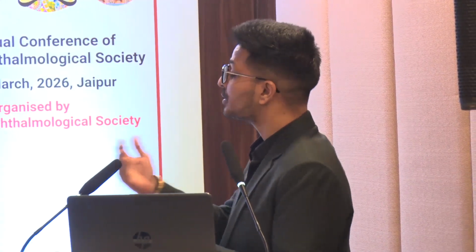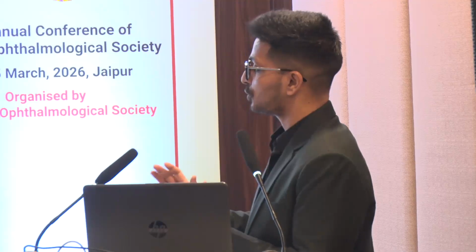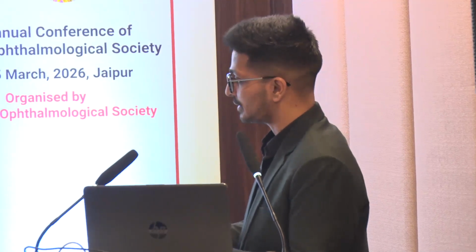Do you think that minus 11? The patient had a very good corneal thickness, more than 645. So then, if he had very good corneal thickness and everything, why did you want to do SMILE Xtra? The patients were outstation patients. They told us they cannot come for regular follow-ups, so only those particular patients were suggested that they can go for SMILE Xtra.